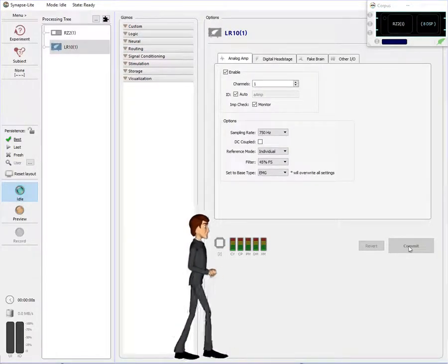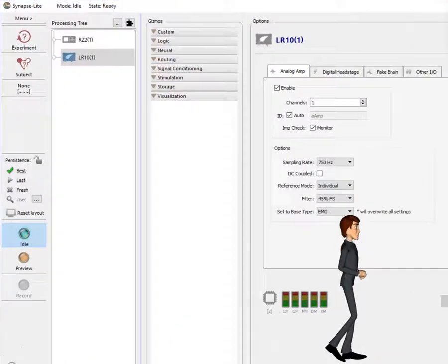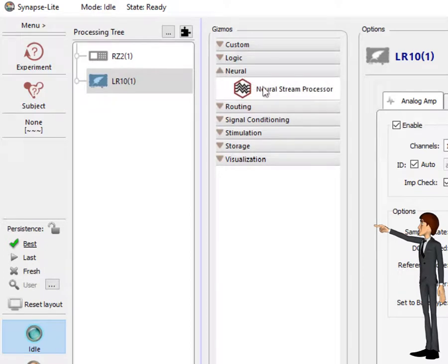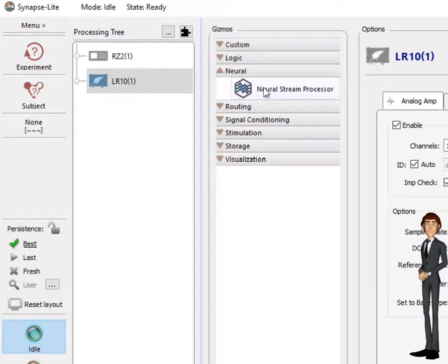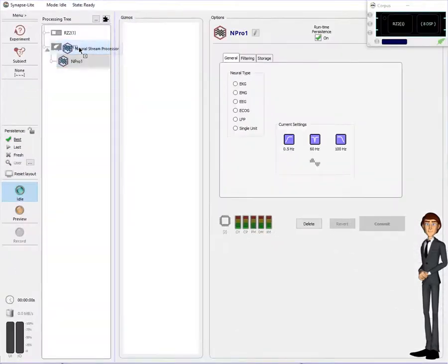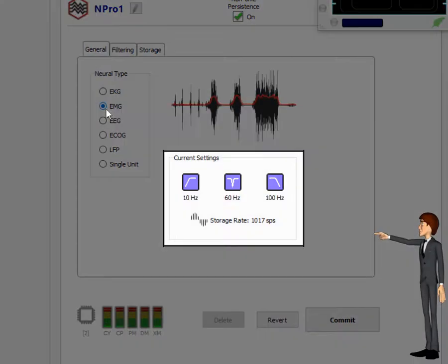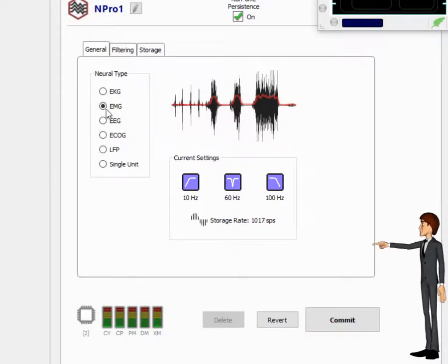In Synapse, we add functionality to an experiment by adding gizmos to the processing tree. Let's add a gizmo from the neural category to filter and save our EMG signal. Drag and drop the neural stream processor gizmo on the LabRat icon in the processing tree. In its options dialog, select the EMG radio button, and proper settings for filtering and data saving will be selected automatically.